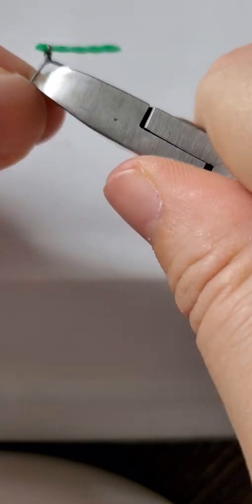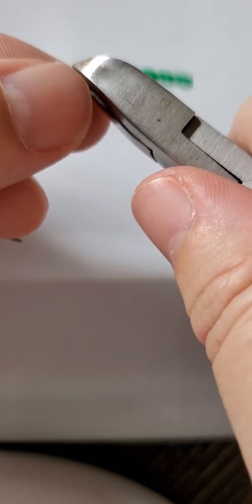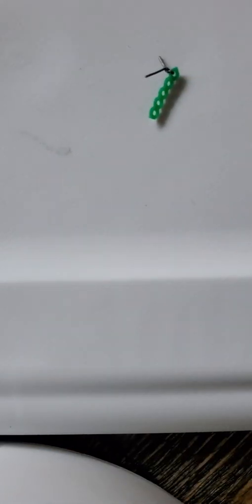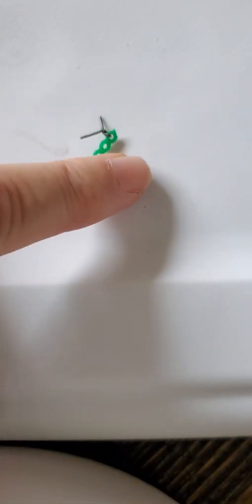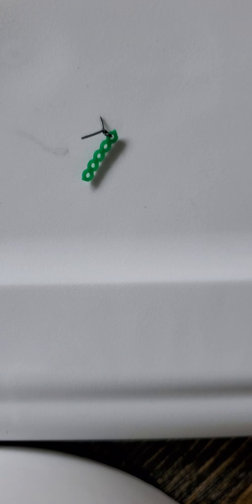Sorry. I'm trying to cut this while looking through the lens of the video. Okay. That's probably a little too much slack, but you kind of get the idea. You want to leave a little bit of a slack. It doesn't hurt or anything.